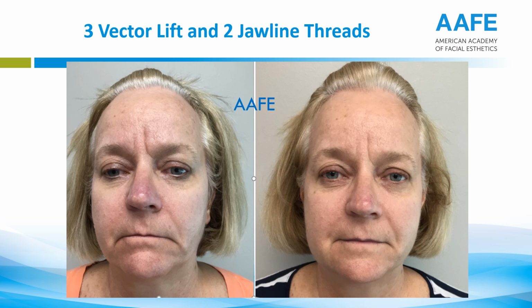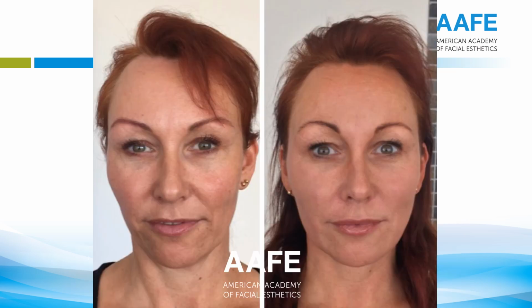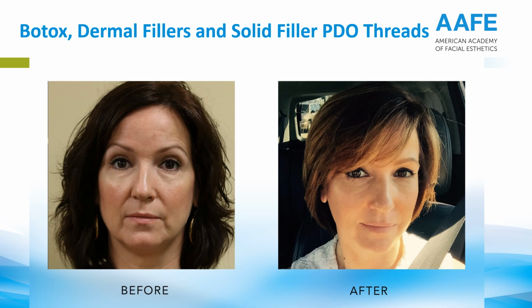I'm here to do what is best for the patient, get the best result with the fewest amount of PDO threads. And when you're properly trained and you're using the right PDO thread, these are the kinds of results that you're going to get with all this. But again, when it comes to total facial aesthetics, it is about a patient like this.